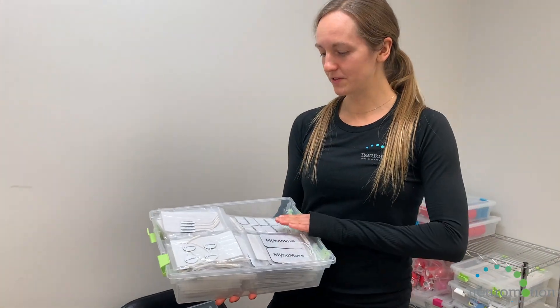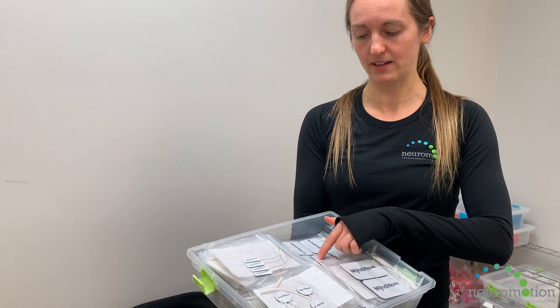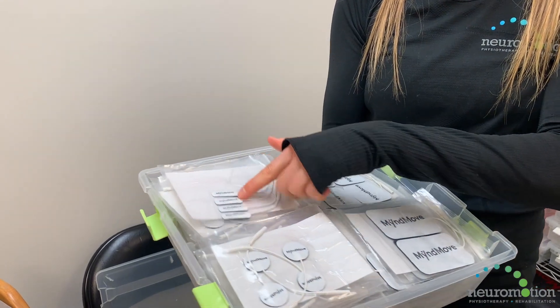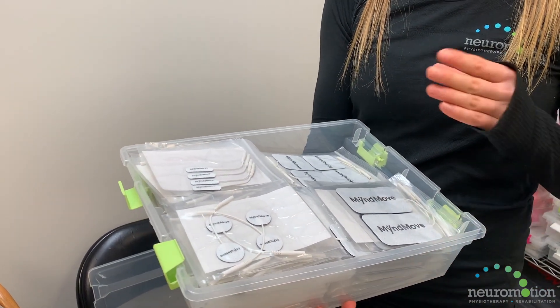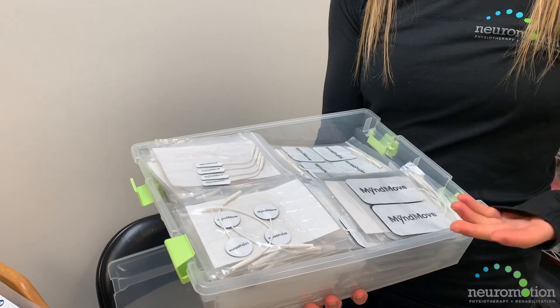With the Mindmove device we have different electrodes in different sizes depending on which muscles you're targeting. Normally you use standard sizes for the arm, but we also have bigger pads for the shoulder, as well as smaller pads that work on the lumbricals in the hand for more specific muscle activation. I also have a circular electrode that can be used for smaller muscles or the thumb.